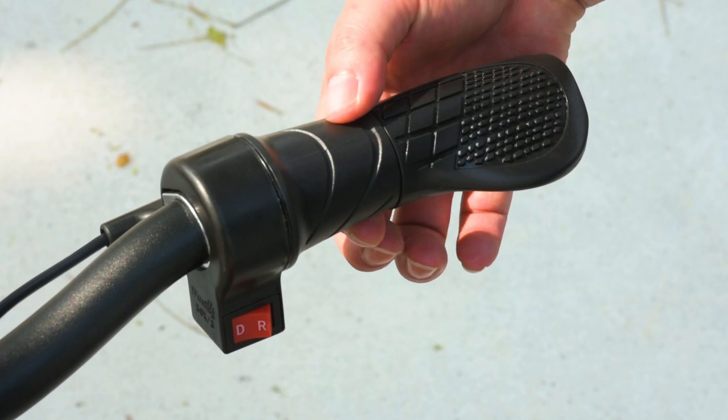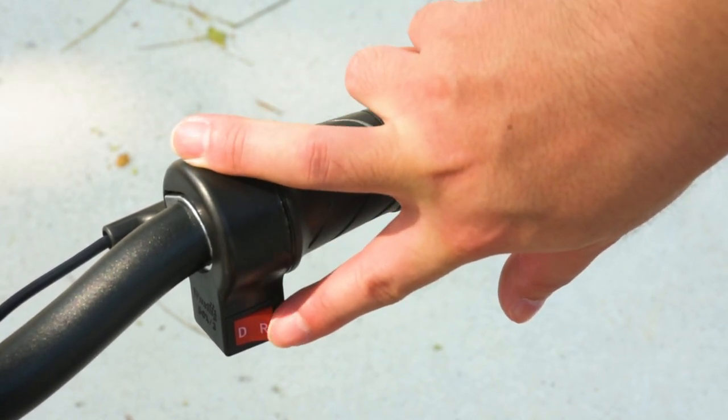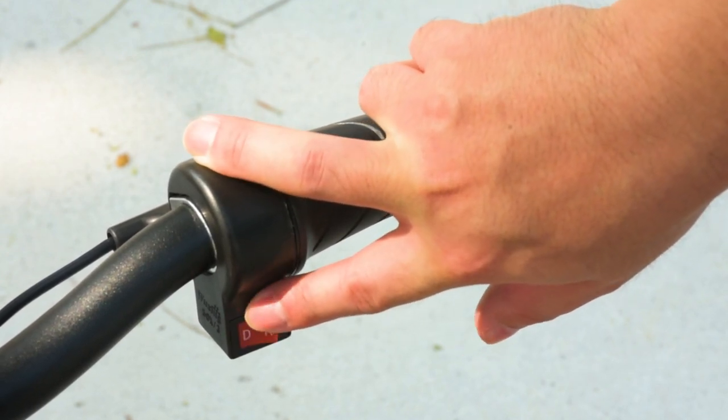This is the grip throttle that powers the motor when pulled. The switch at the bottom toggles between forward drive, indicated by the letter D, and reverse drive, indicated by the letter R.